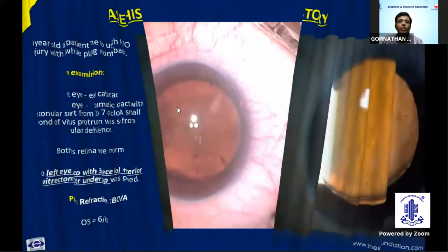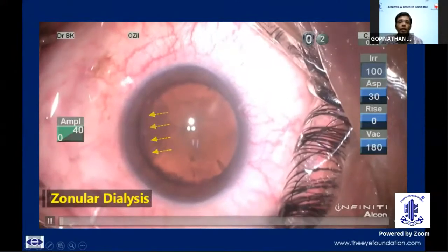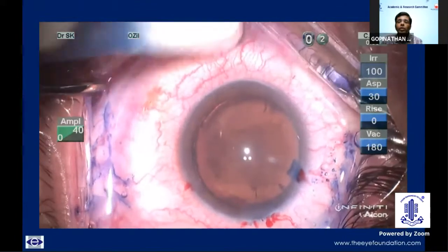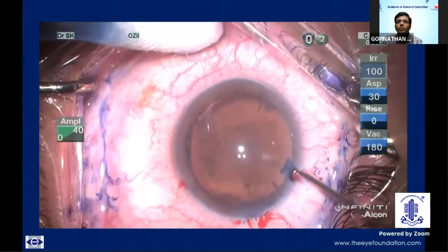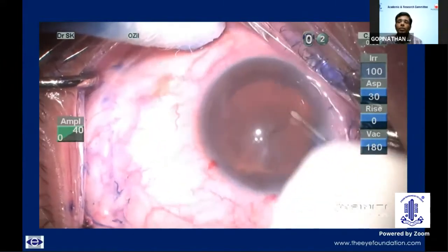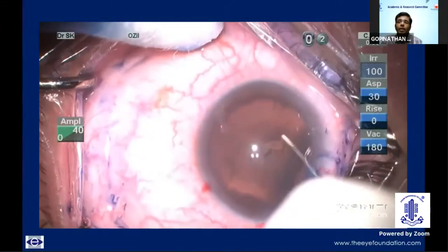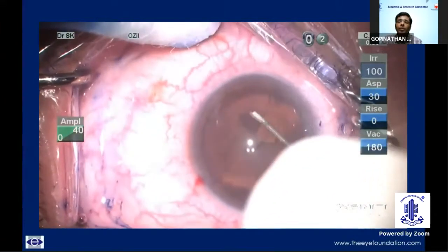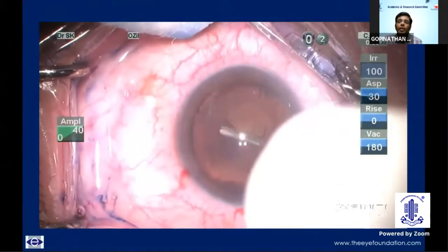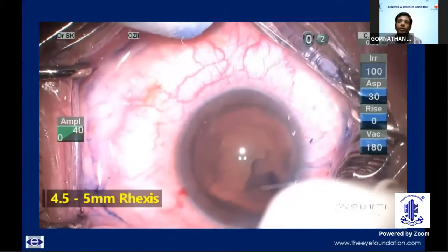For this case of left eye surgery, this is the case video. As we can see, the zonular dialysis is extending three to four clock hours from 3 to 7 o'clock position, with only a small frond of vitreous trying to come out from the zonules. Initially, I did not go ahead with any anterior vitrectomy. I made a rhexis of 4.5 to 5 mm deliberately so that it could accommodate sulcus placement of IOL with optic capture if needed later during the course of the surgery.